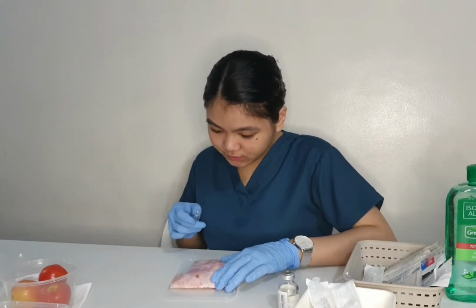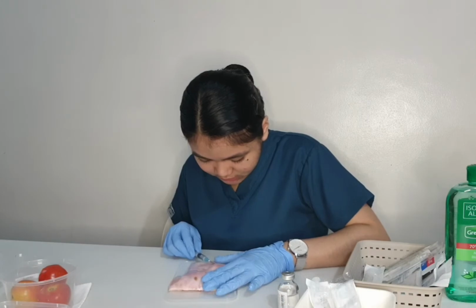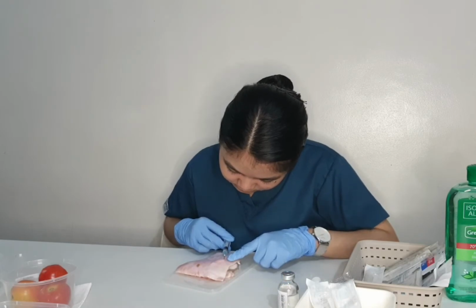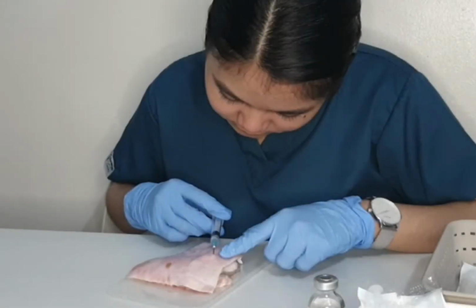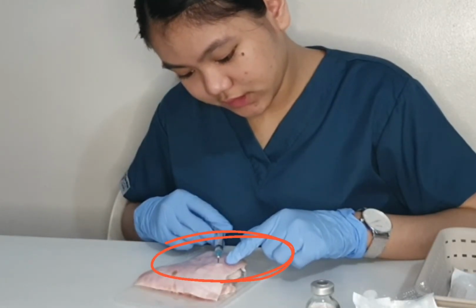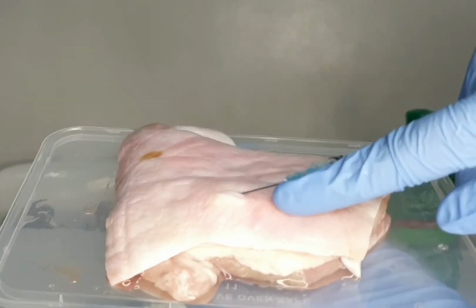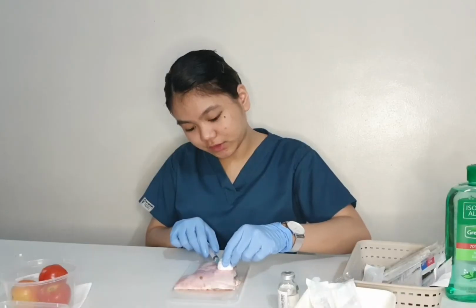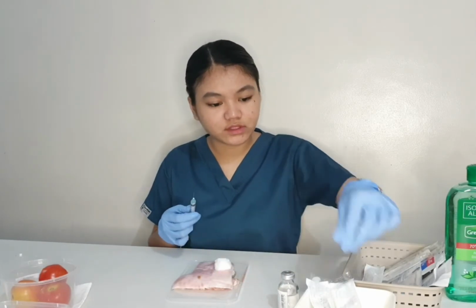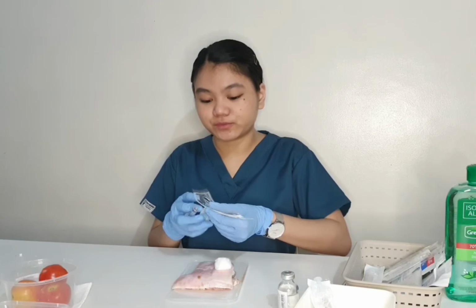Okay, so the needle hole must be facing upward and inject it on the skin of the pig. The skin of the pig is actually turning white. There, I have already created a bleb. There you go. That's a bleb. Then remove the needle. Okay, let's use this again. Remove the needle. Throw it in the sharp tools.